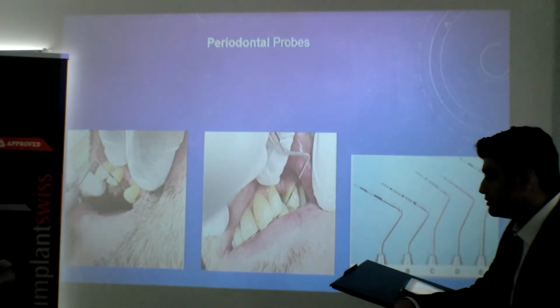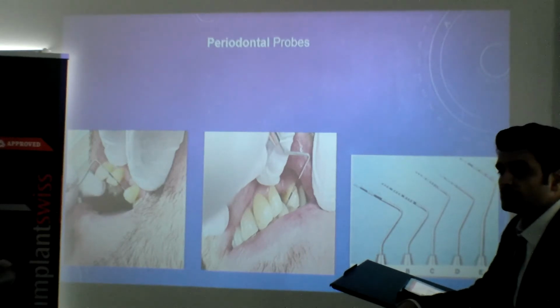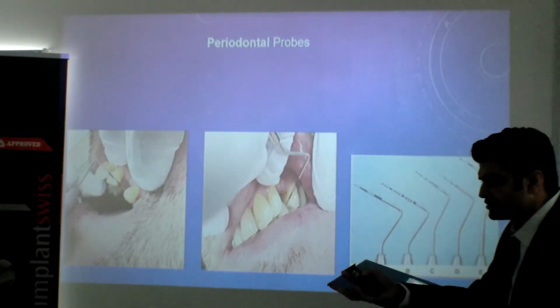Coming down to measurements, we were saying that we're going to be taking measurements with photographs. So you are preparing now, the case is getting ready. You've got a few issues. What issues are you going to be catching, or what are you trying to achieve from these photographs? Measuring if there's enough space and there's no drifting of teeth. You may have missed some things when you are doing a dental checkup, because you're concentrating on a lot of other things.